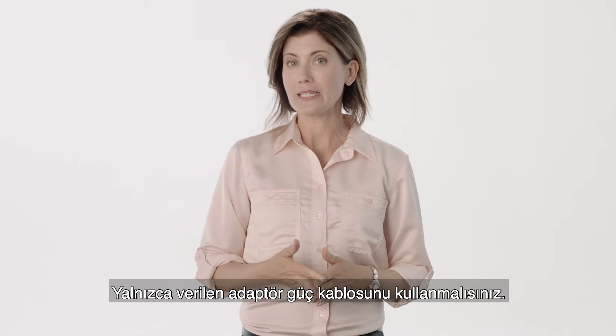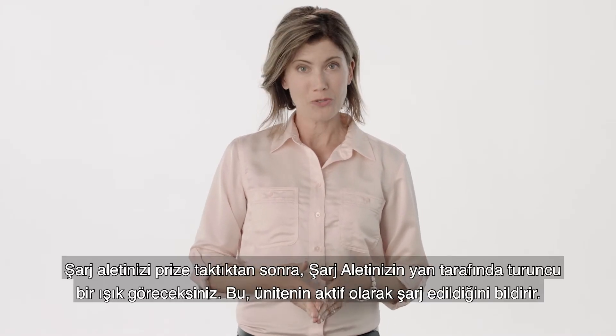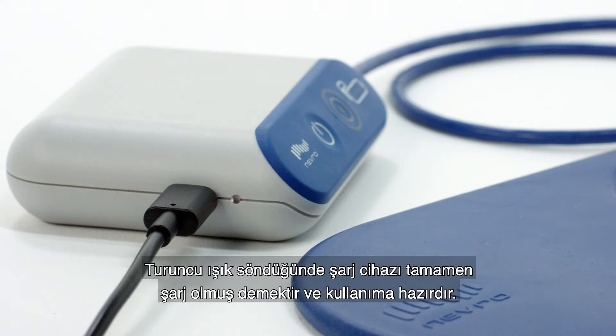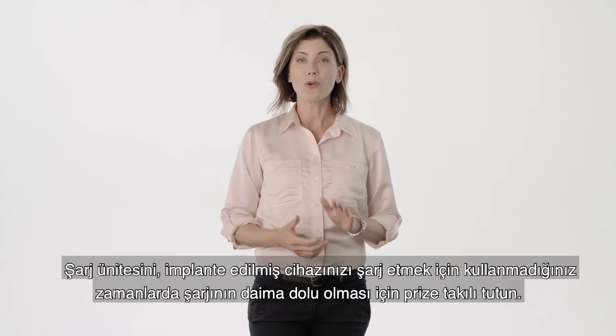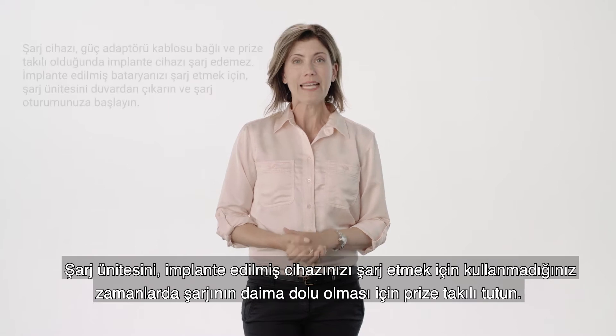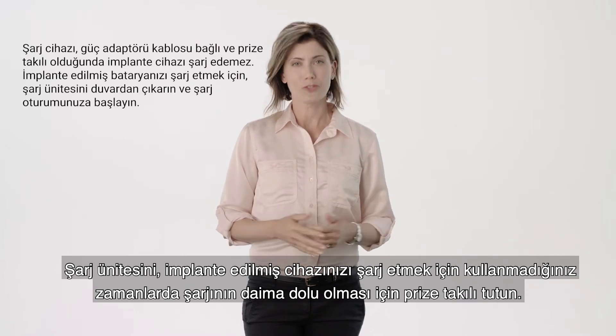You should only use the provided adapter power cord. After you plug your charger in, you will see an orange light on the side of the charger illuminate. This lets you know the unit is actively charging. When the orange light turns off, the charger is fully charged and ready for use. When you are not using the charging unit to charge your implanted device, keep the unit plugged into the wall outlet so that it's always fully charged.